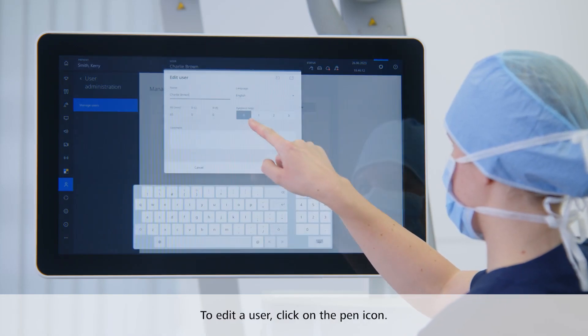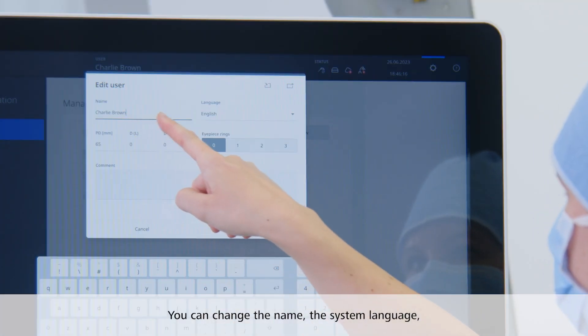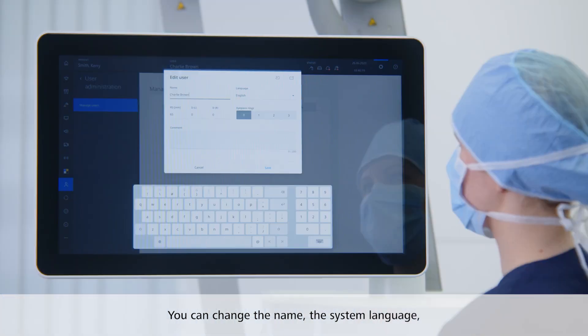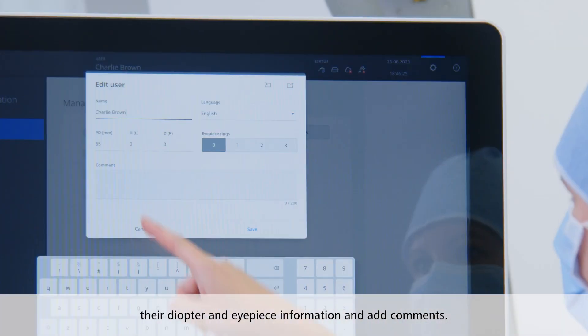If you want to edit a specific user, click on the pen icon. You can now change the name, the system language for this user, their diopter and eyepiece information, and you can add comments.